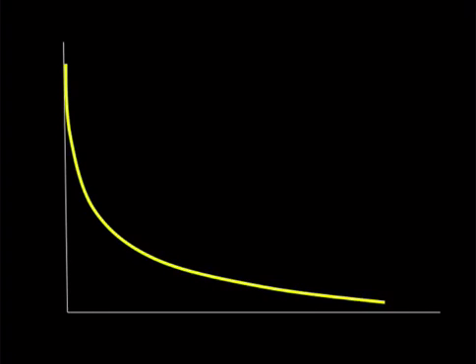So instead of giving away energy into a lattice or thermal loss, T1 like the thermometer, it's this interaction between each other, the spin-spin interaction, that causes this T2 decay. And the rate of decay is also an exponential process, so the T2 relaxation time of a tissue, as far as the constant of decay, is when 63% of the transverse magnetization is lost. In other words, 37% remains.